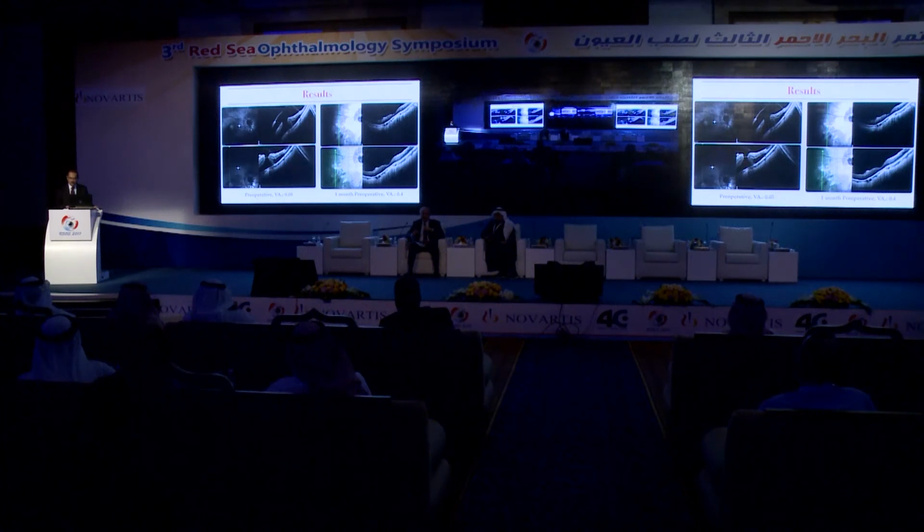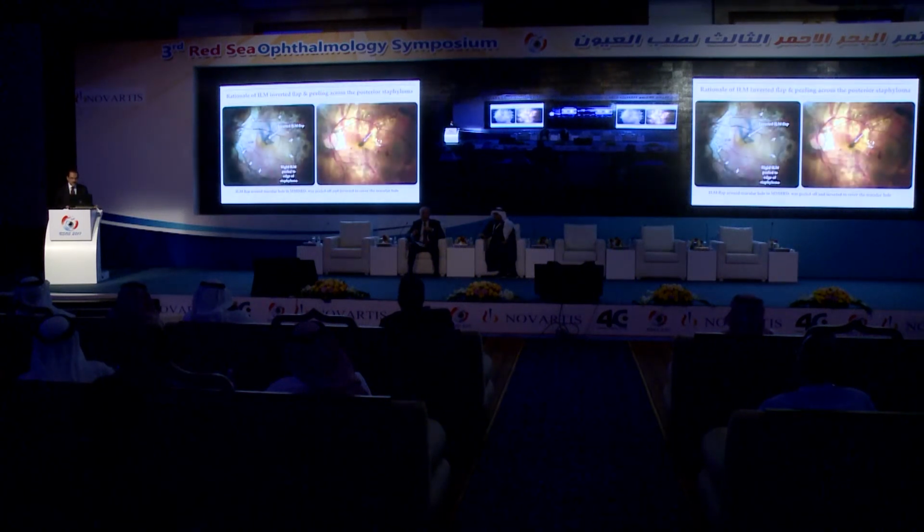These are other cases with improvement in the vision to 0.4. And this is how the internal limiting membrane is left over and not inside the macular hole, in order to help in sealing the macular hole.